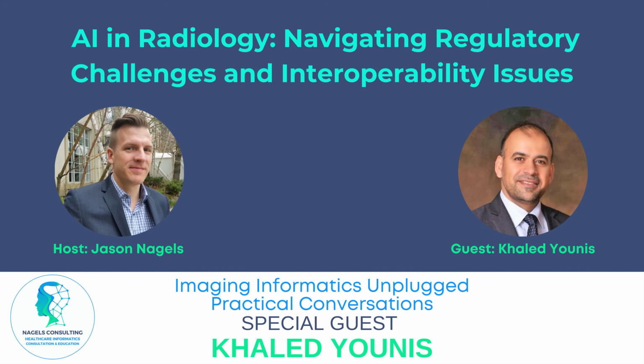A model trained on, say, the Kansas City population is not going to apply to that population, and you could apply that to any two different cities. That is fundamentally a data challenge, a matter of what you are training the models on. But I'm wondering if there's more to it that you can explain, and how we can look at mitigating bias in those types of scenarios.